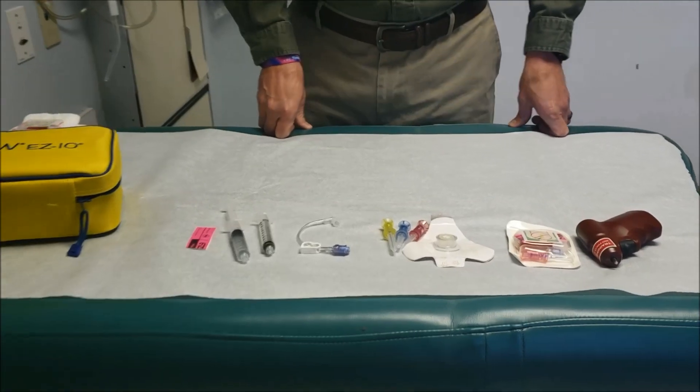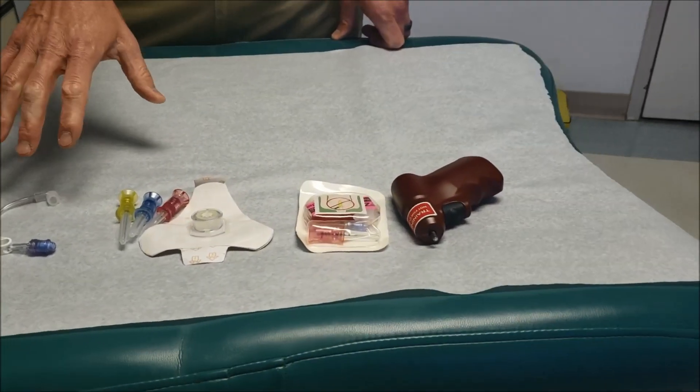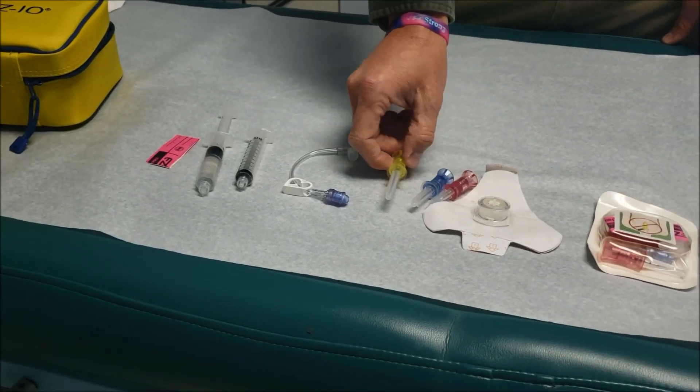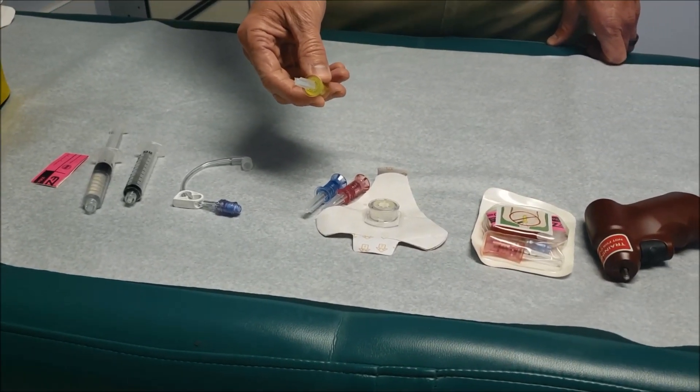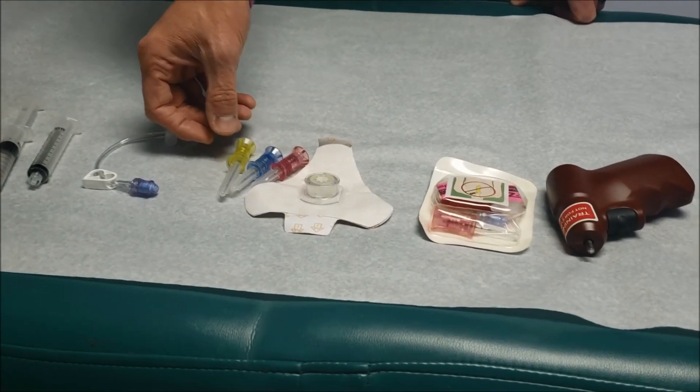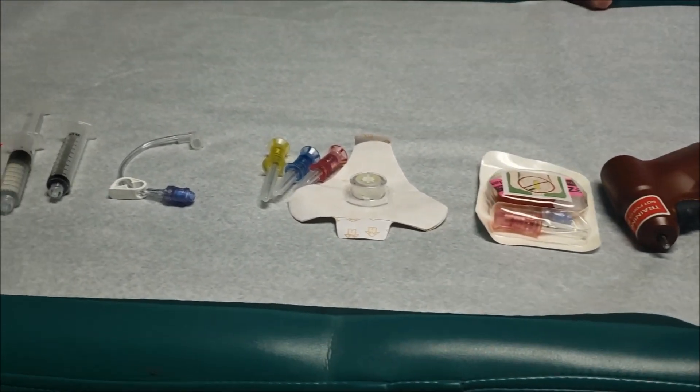Hello, this is the quick hit on the EZIO insertion. Here's the basic equipment you're going to need. I want to highlight that the 45 millimeter needle, the yellow one, is the needle of choice for your proximal humerus insertion in any patient that's a code within the hospital.